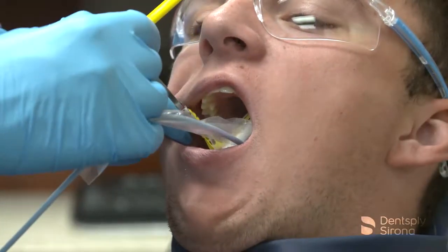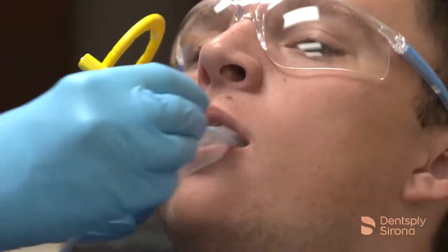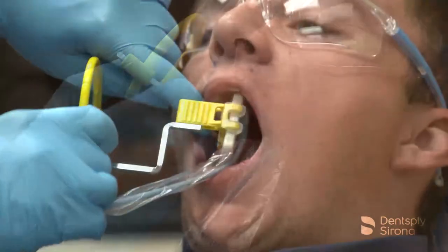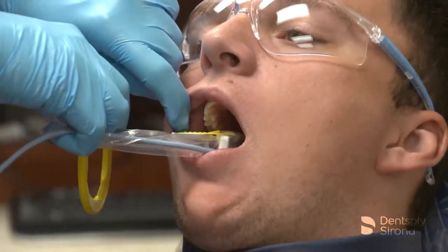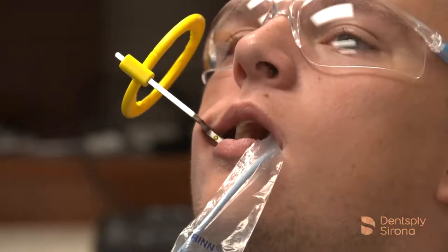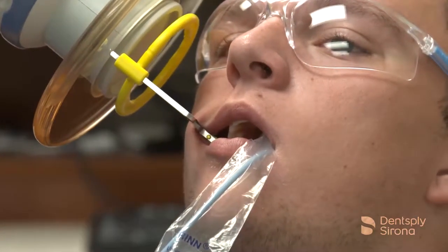To obtain images of the maxillary or mandibular posterior teeth, guide the image receptor into the patient's mouth, allowing the sensor to find its way comfortably. Center the sensor behind the tooth being captured and rest the bite block on the tooth's occlusal surface. Instruct the patient to close slowly, align the handheld portable x-ray device, and capture the image.